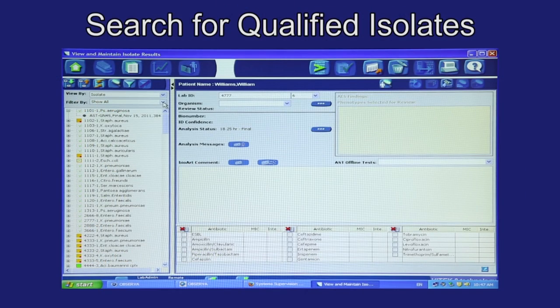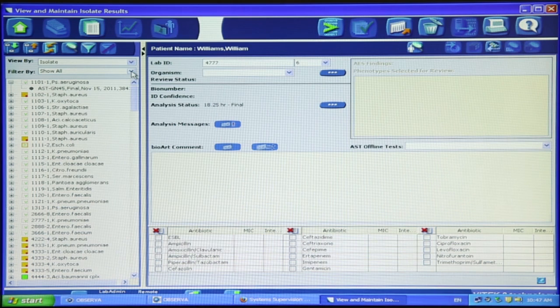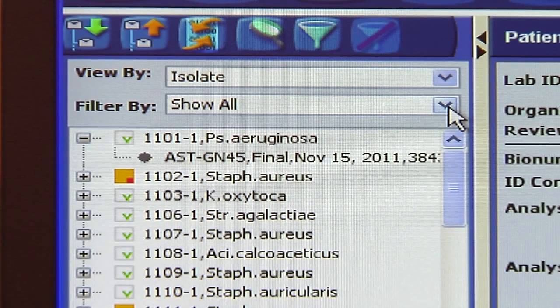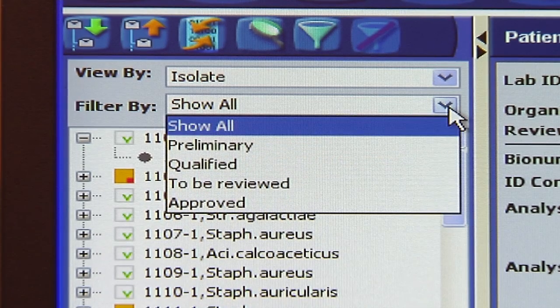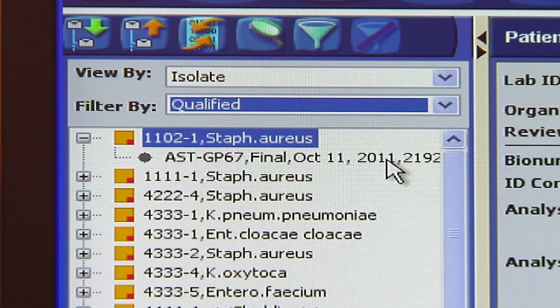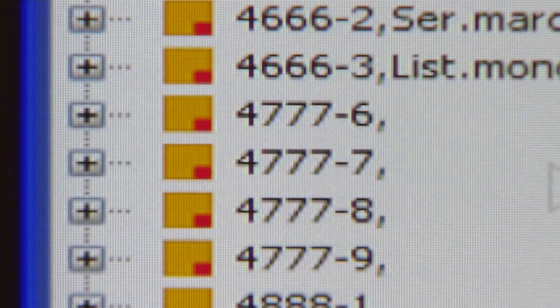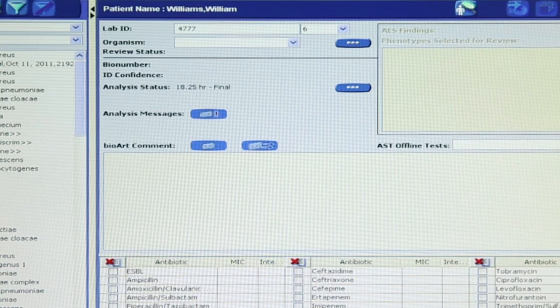Now that we know what can cause an isolate to be qualified, let's search for all qualified isolates so we can resolve them. From the main view, navigate to the View and Maintain Isolate Results view. In the upper left-hand corner, just above the navigation tree, click the filter-by field to display a drop-down list and select Qualified. Only qualified isolates will display in the navigation tree. To begin resolving qualified isolates, click on a qualified isolate group to select it and display the results in the working area of the screen. Examine the isolate to determine which required information is missing.